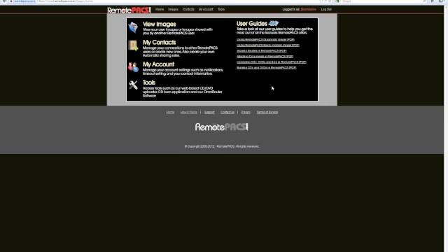It's a cloud storage service for medical imaging. It's a PACS system where we host the servers, we host the internet connection, and you can access it that way. We store all of the images that we receive for a minimum of 7 years. So you don't have to worry about making sure that you're keeping your studies for the right amount of time. We've already done it for you. It's included in the service. There are additional extended years that can be purchased. If you're interested in that, just let me know and we can work something out.